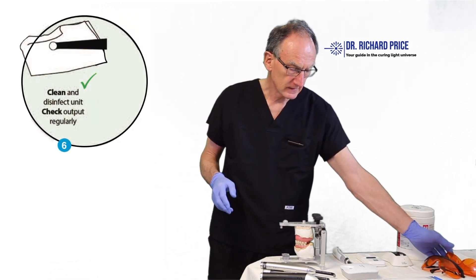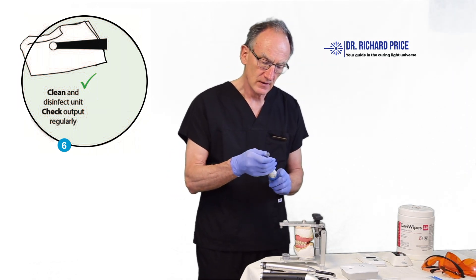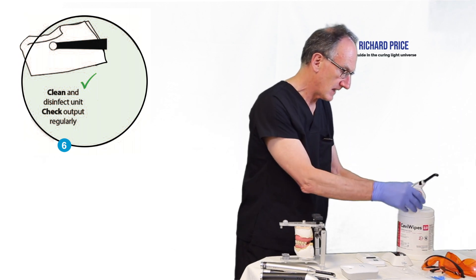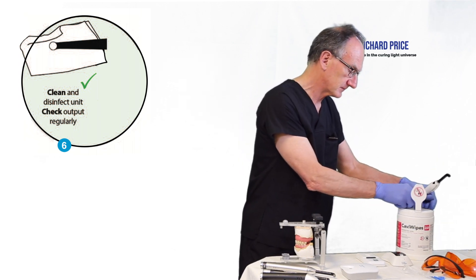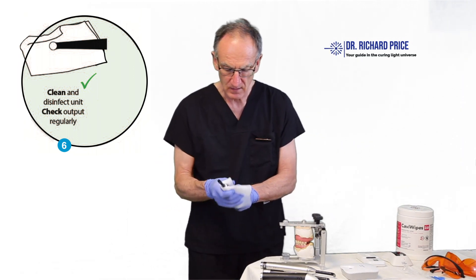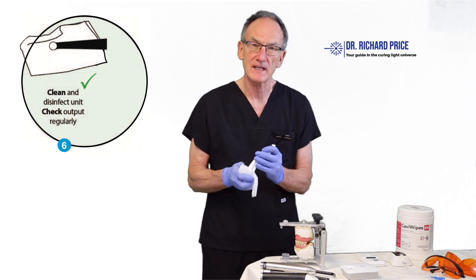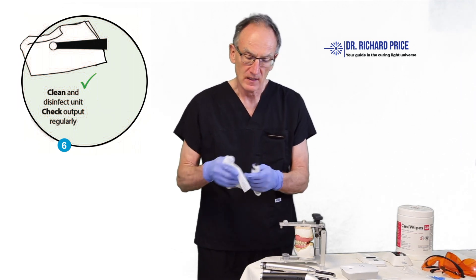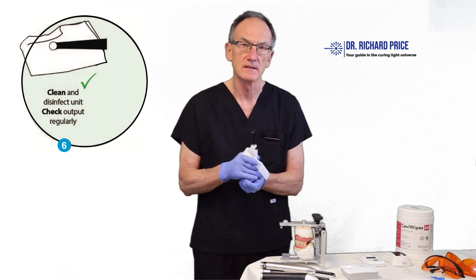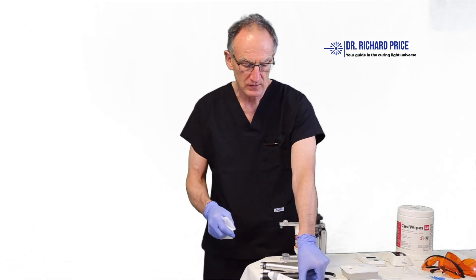When you've finished light curing and the patient has left, remove the barrier cover from the curing light and dispose of it properly. Then take a disinfectant wipe and wipe down the curing light. Always use the disinfectant wipe recommended by the manufacturer — check with your sales representative if you're unsure — and then leave it to dry.